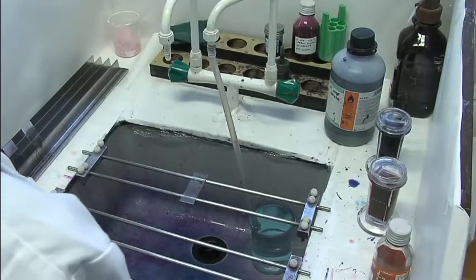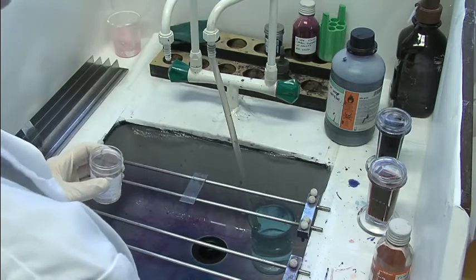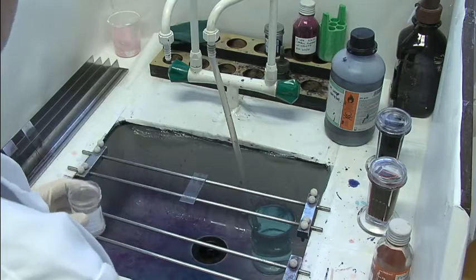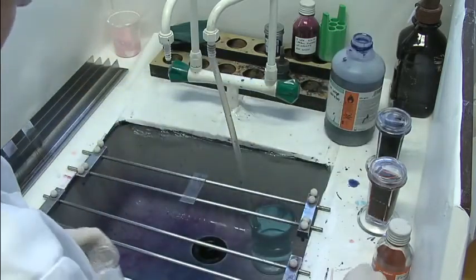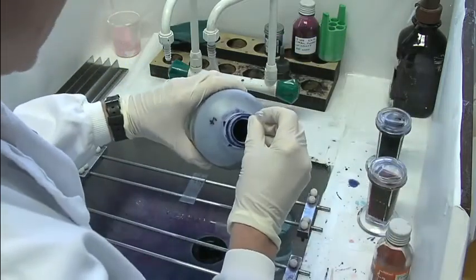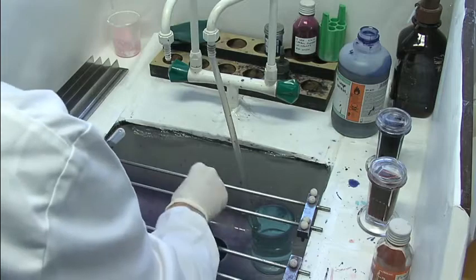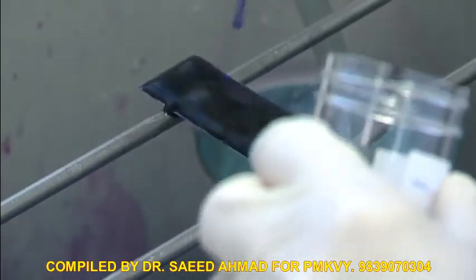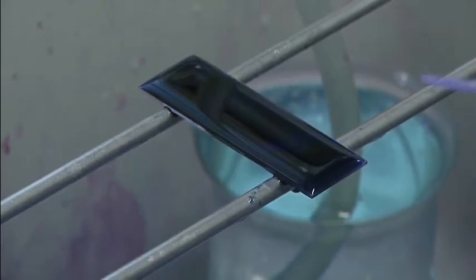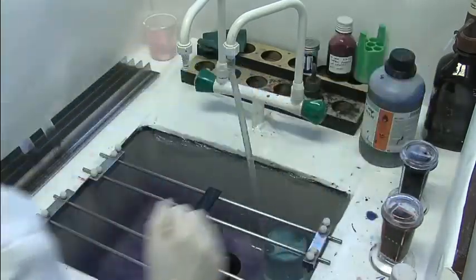When staining with Giemsa, which we would always do for a non-falciparum, we have 9ml of buffered water, and it must be buffered at pH 7.2. In haematology it's usually buffered at 6.8, but for malaria films it must be at 7.2. Take 1ml of stain, mix it together, and then use it immediately to stain the slide. You can't use Giemsa that has been made up for any length of time because it starts to deposit, so always make it up fresh, and it must stain for half an hour. Normally at this point you would put on a timer, and tap water can be used to wash it off after half an hour.